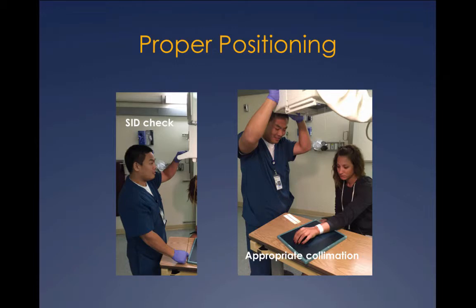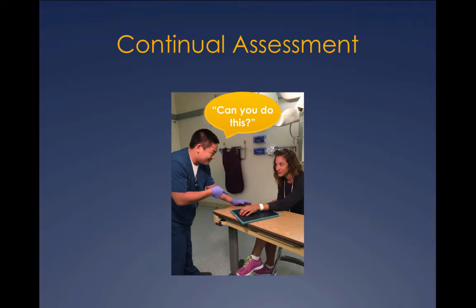Next, and most importantly, position properly, maintaining correct SID selection and appropriate collimation. Continually assess your patient throughout this entire exam process, making sure that they're able to do what you're asking them to do.